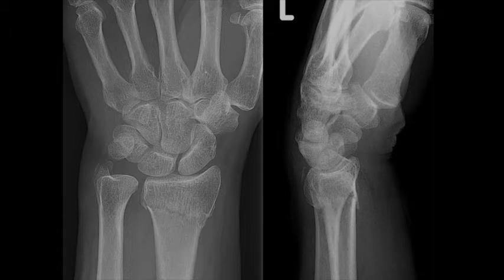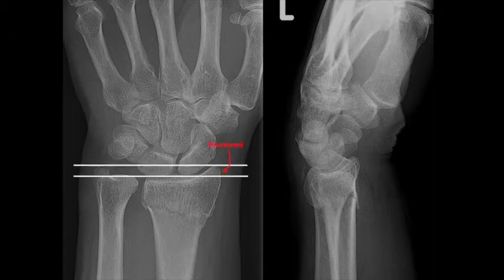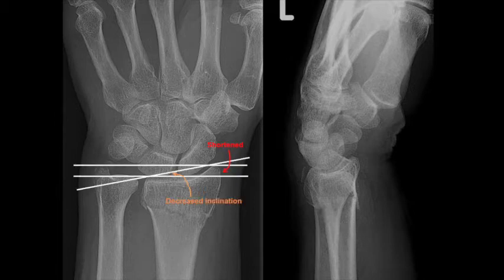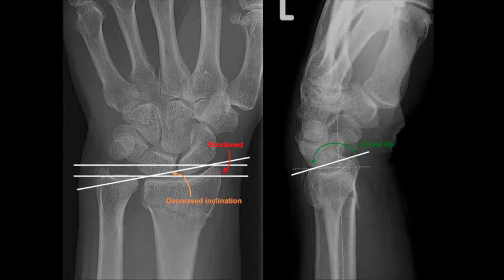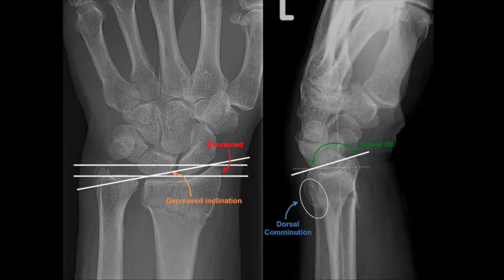Now that we've covered what normal distal forearm radiographs should look like, we can interpret the pathology seen here. Number one, the radius is shortened. Number two, there is decreased inclination. Number three, there is dorsal tilt at the distal radius on lateral x-ray, as opposed to the normal volar tilt. And number four, there is also often dorsal comminution.